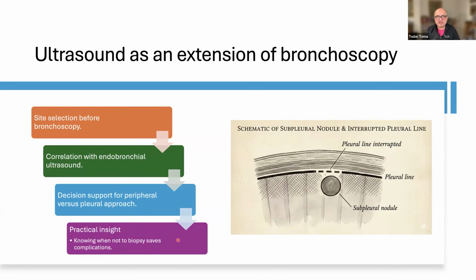The ultrasound is very sensitive to say that the patient doesn't have a pneumothorax, and therefore it's very helpful for this procedure.